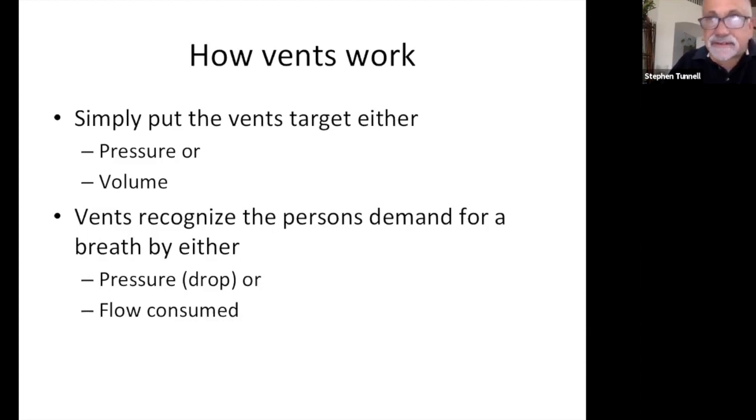So the only person attached is the patient; they must be pulling and wanting a breath to be delivered. Or it sees, hey, the flow that I put into my circuit didn't come back. There's only one guy here who's taking that. It's the patient. They must want a breath. So it recognizes the person's demand for breathing by either looking for pressure drops or seeing that airflow was consumed from the circuit. And it's really that simple.